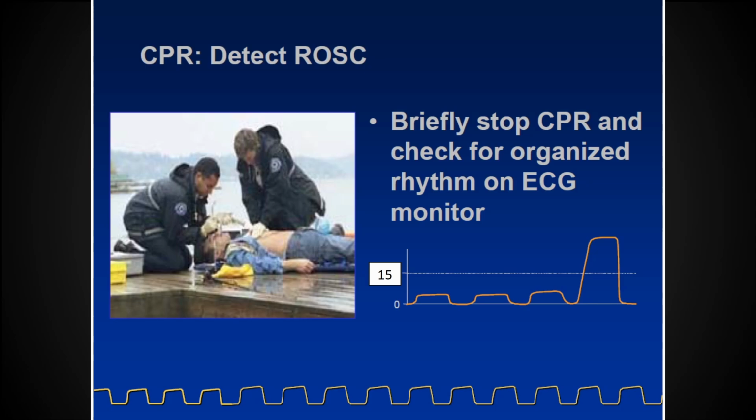What's happening in the tissue? Metabolism is happening, which means it must have had what and what? Oxygen and glucose. So then where did that oxygen come from? From the blood. The blood went back to the lungs. So now I have learned, because of the sudden end tidal spike, it is implying that from start to finish, it's boomeranged all the way around.